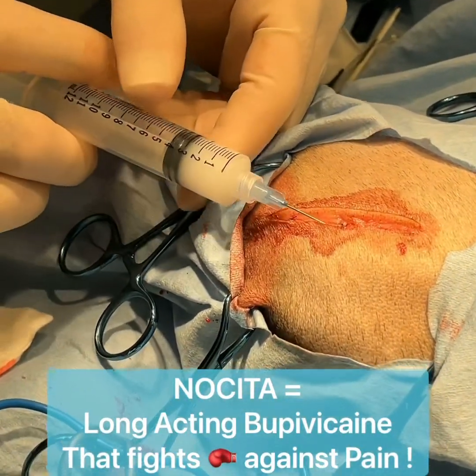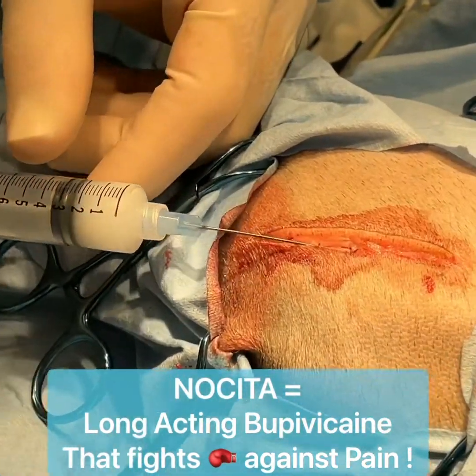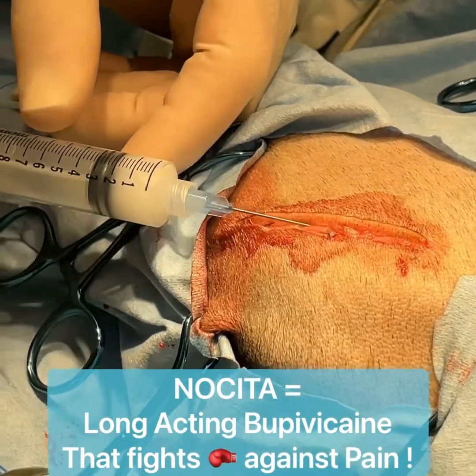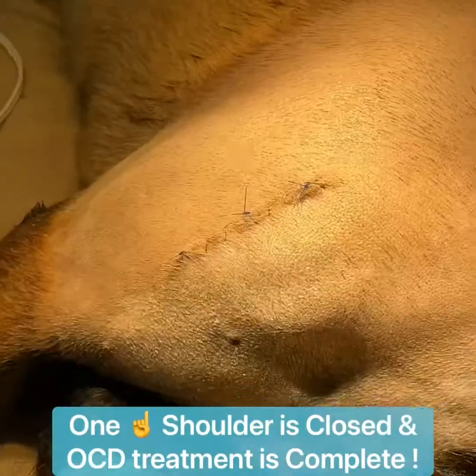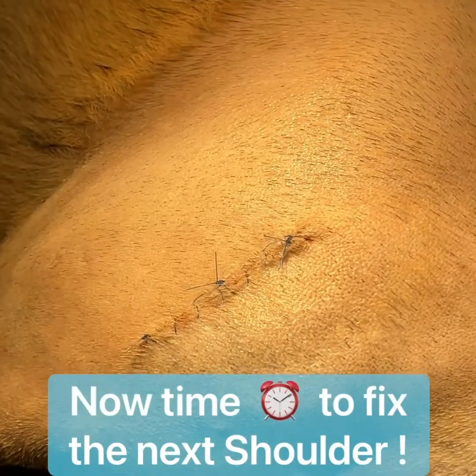Now we are infusing the surgical area with Nocita. Nocita is a three-day pain block, a nerve block. Now we have the incisions closed and we move to the other side.